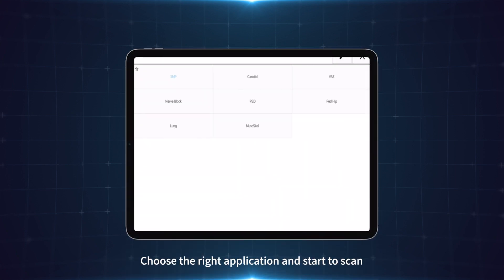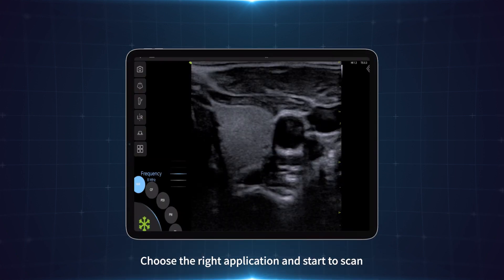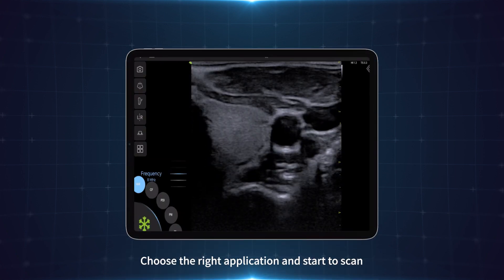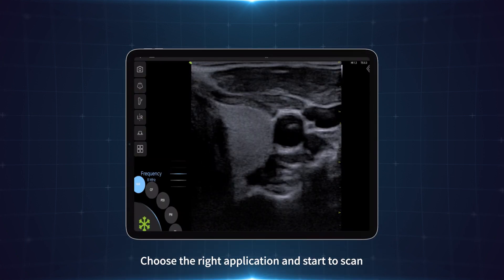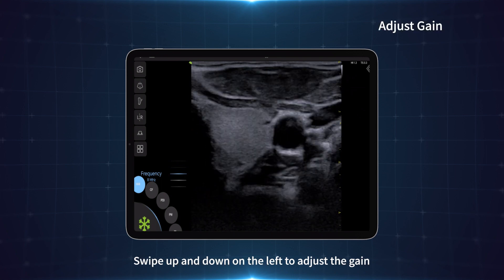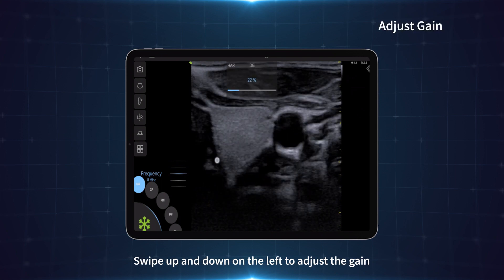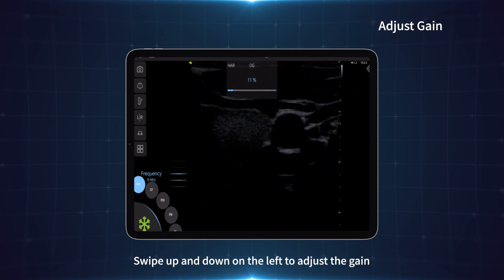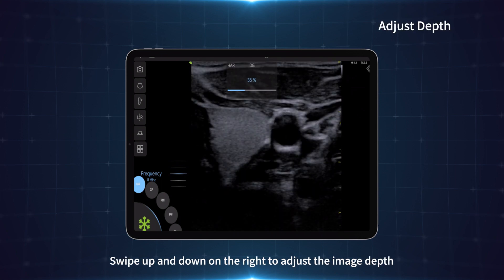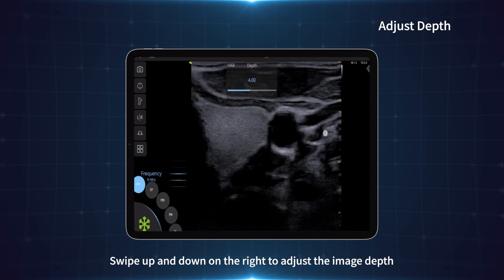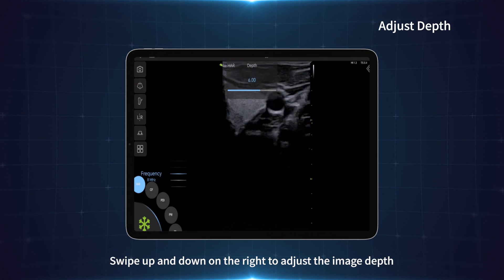Choose the right application and start to scan. Swipe up and down on the left to adjust the gain. Swipe up and down on the right to adjust the image depth.